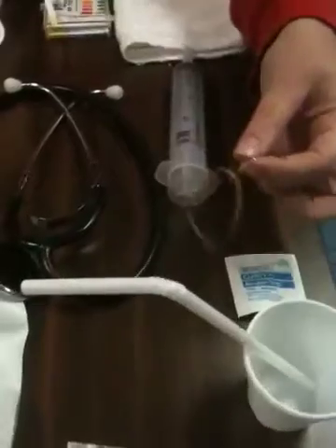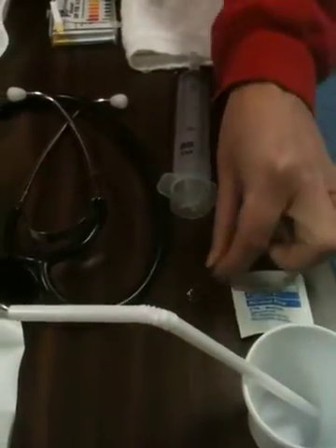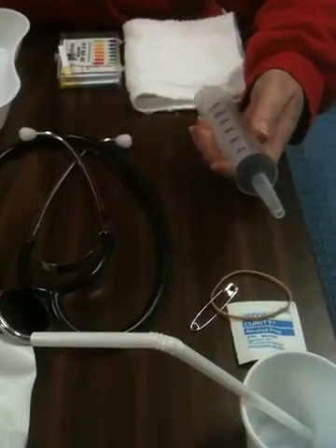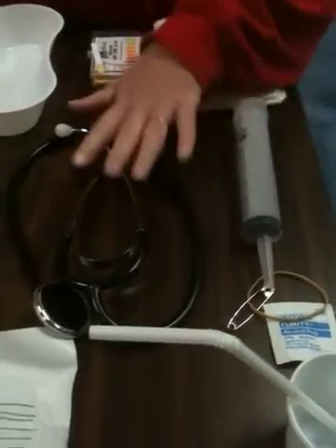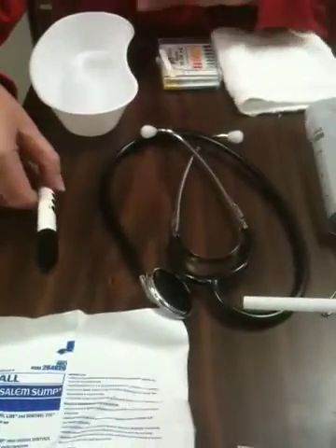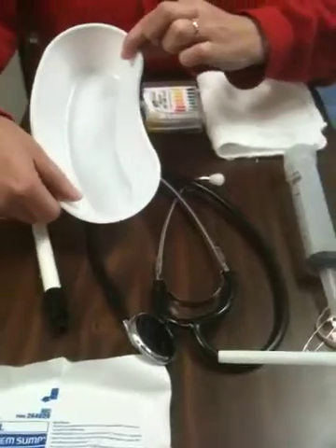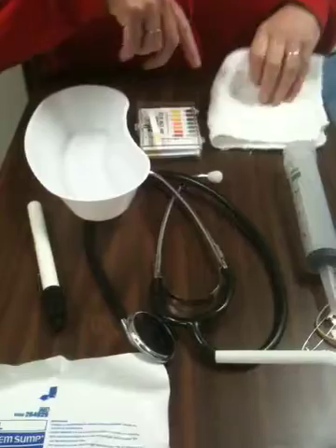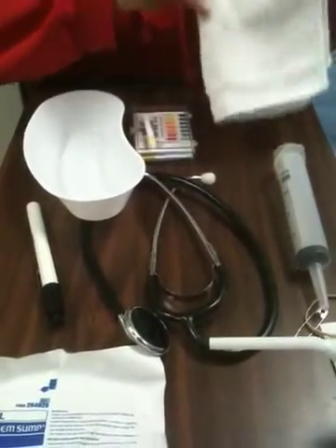We have our lubricating jelly, which is water soluble, and a cup of water with a straw. We have our alcohol pad, our rubber band and safety pin, our catheter tip 60 milliliter syringe, stethoscope, pin light, emesis basin, pH strip, and then we would need Kleenexes and or a washcloth for the patient.